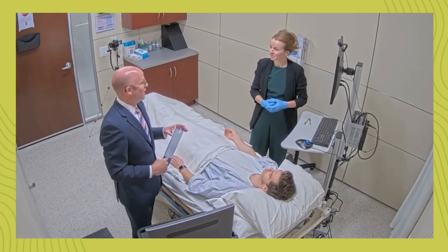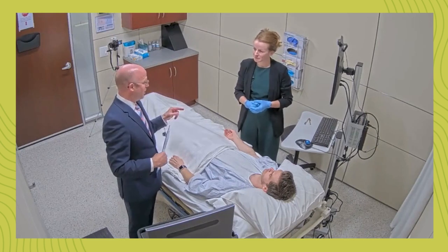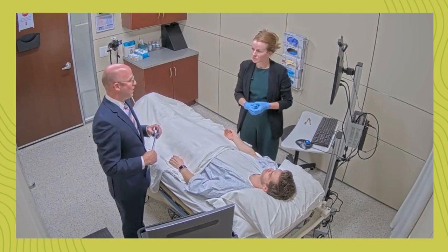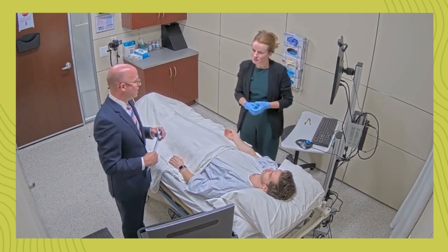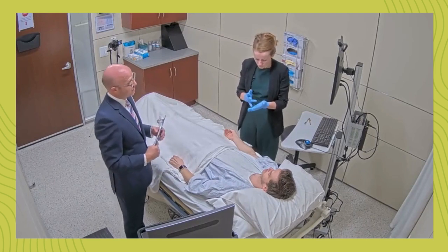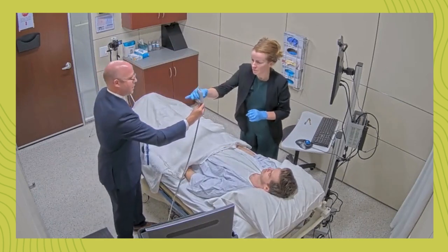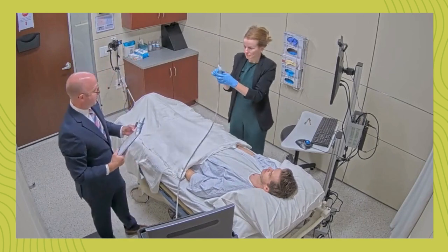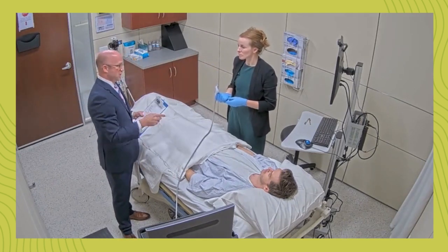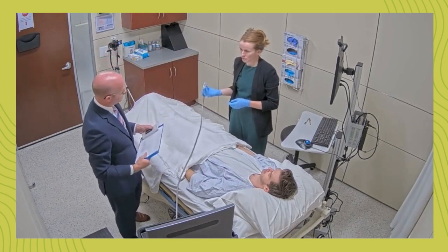You have successfully placed an IV in your patient. Remember, the patient came in originally complaining of right lateral thigh pain. What I'd like you to do now is demonstrate with ultrasound how you would assess that area for any signs of soft tissue infection. Which probe would you like to use to do that? I think I'd start with a linear probe also, please. Please demonstrate and describe to me how you would use the ultrasound to image his right lateral thigh for soft tissue concerns.